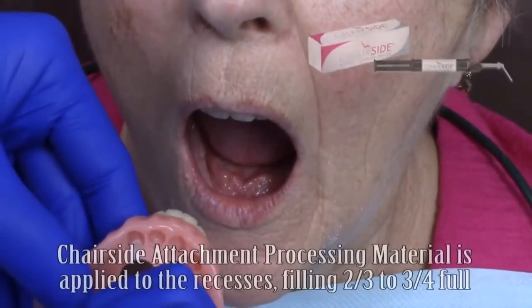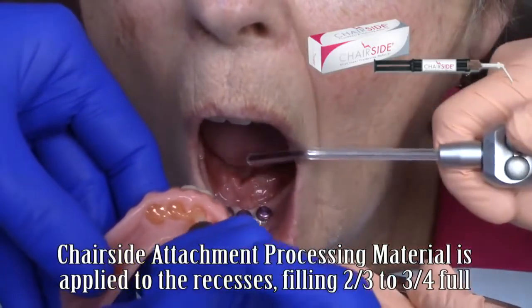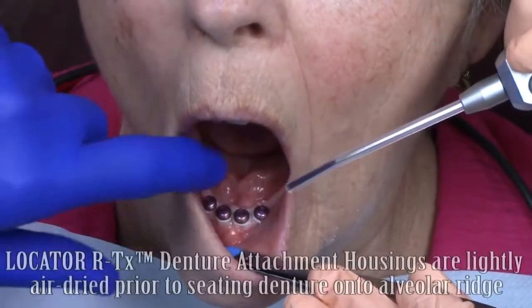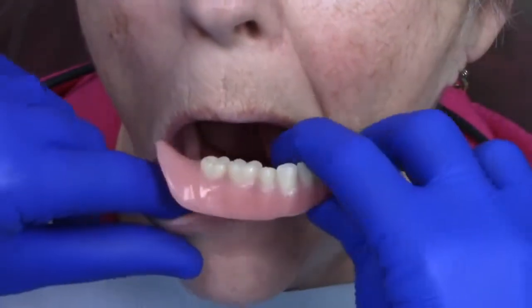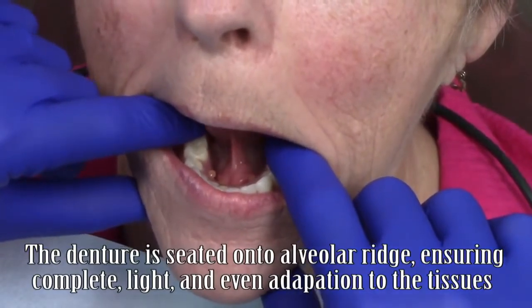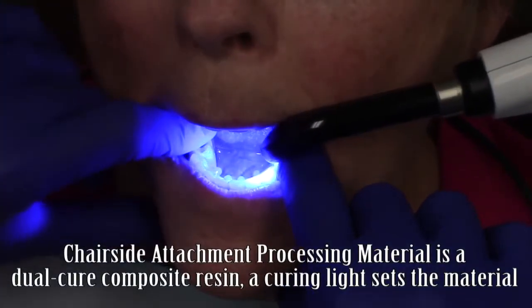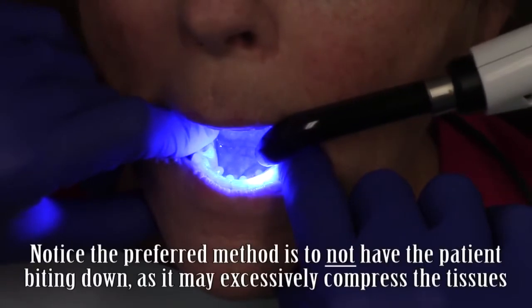Chair side attachment processing material is injected into the recesses of the complete denture, filling the recesses approximately two-thirds to three-quarters full. Note that no primer or bonding agent is needed for this material to properly bond to the denture. Once applied to the intaglio surfaces, the Locator RTX housings are lightly air-dried prior to seating the complete denture back onto the ridge. Using gentle finger pressure only — no biting forces — I seat the denture onto the ridge, ensuring adequate flow of the attachment processing material out the lingual vent holes to ensure complete tissue adaptation.